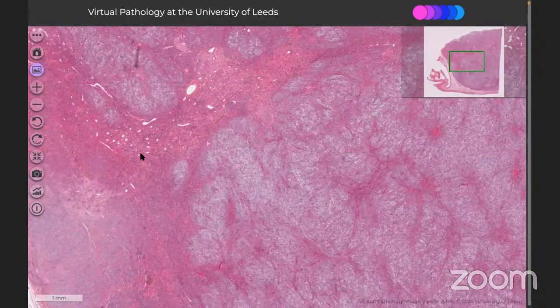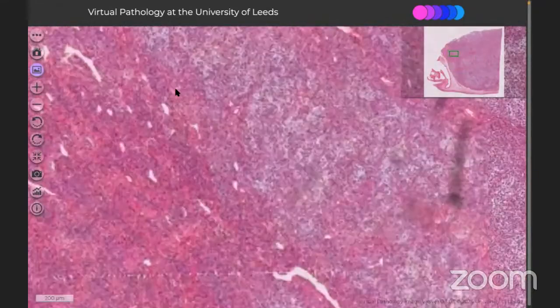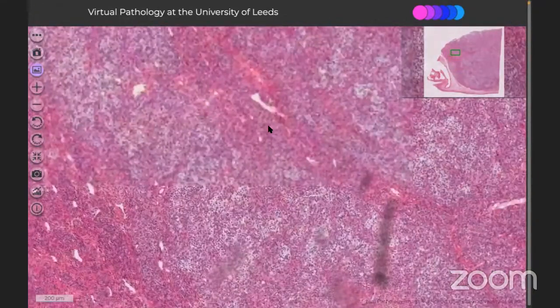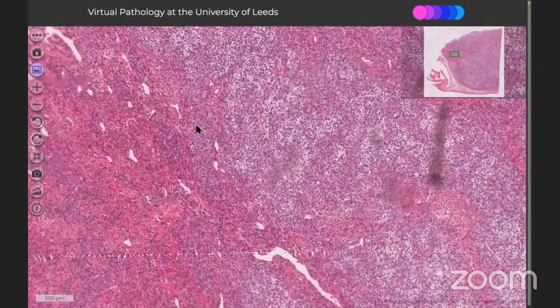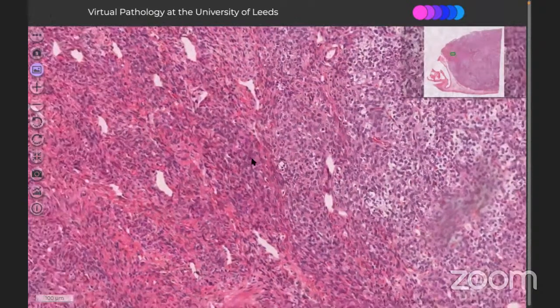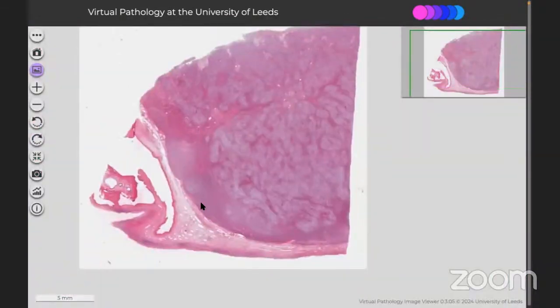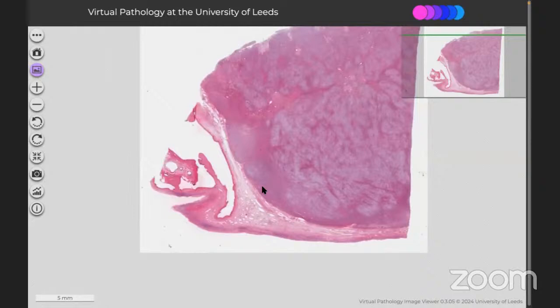You can favor a diagnosis of luteinized thecoma because the thecal cells you can compare with the normal thecal part, which is actually the classical thecal part that we see in any follicular cyst, and this is the luteinized part. So this is the luteinized thecoma, and you can say this in your further workup.